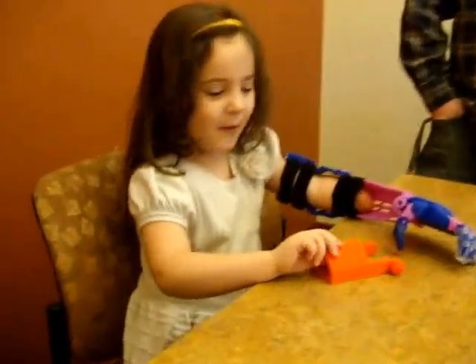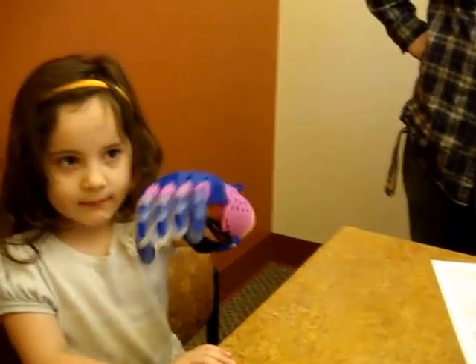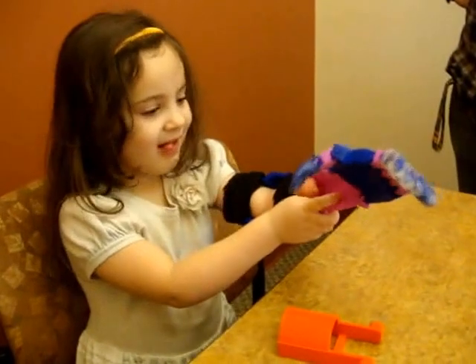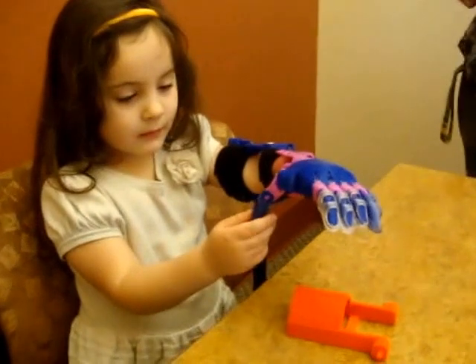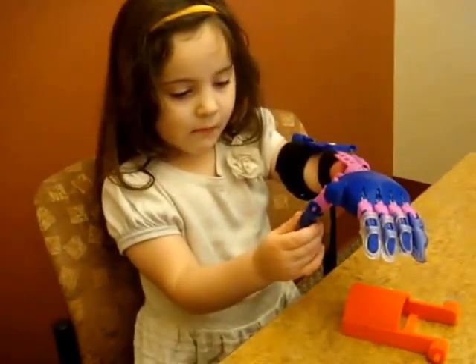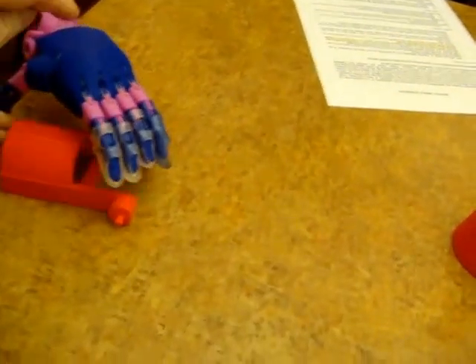Okay, now if you're okay with this, I would leave that arm, and if you could just show me that arm a little bit and bend it like that and lift it and move it around. Do you like the colors on it, Clara? So I will make another one that you can have in case anything happens to this one, that you can use until your dad fixes this one. But it will be blue here and pink here — blue and pink. It'll switch the colors around. Is that okay?